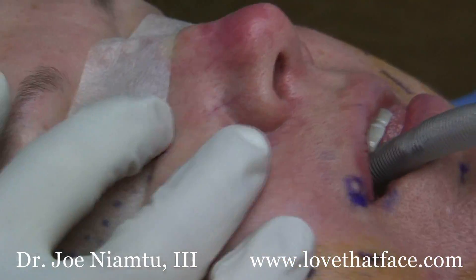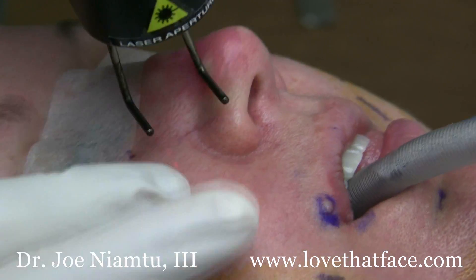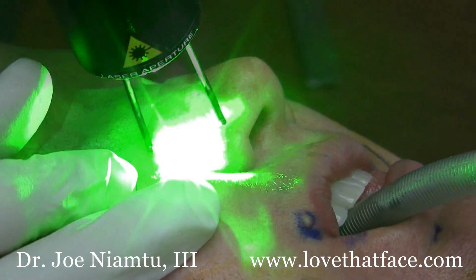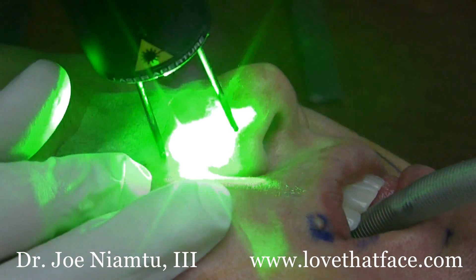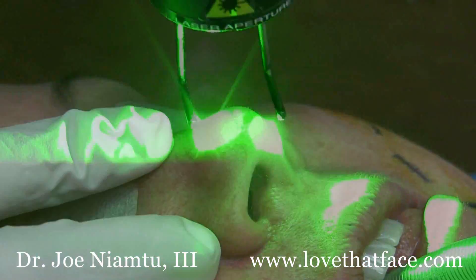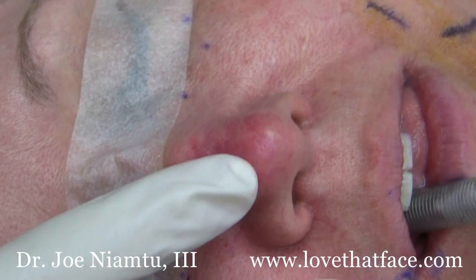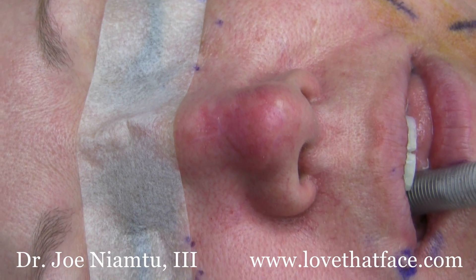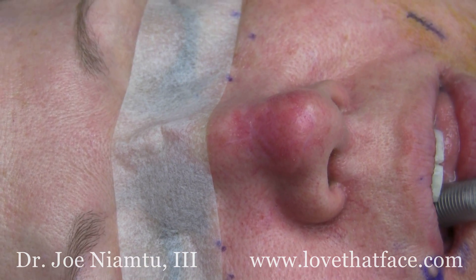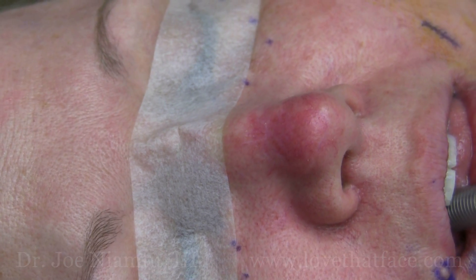Now you can see a bigger one here, and we're going to treat that with the scanner as well. Hopefully you can see the difference — it's pink, but the telangiectasias are pretty much gone. This is Dr. Joe at lovethatface.com treating facial telangiectasias with the Iridex Verilite 532 wavelength laser with the scanning handpiece.